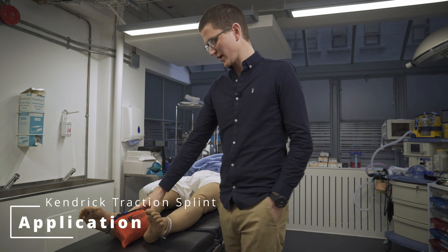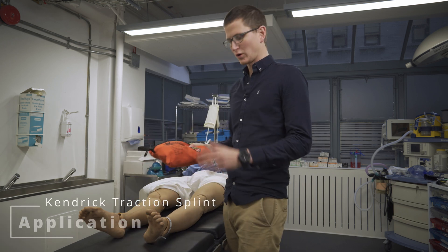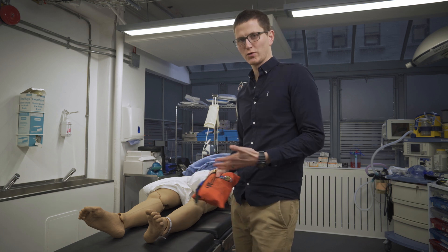Today we're going to be going through the Kendrick Traction Splint. We're going to talk about when to use it, when not to use it, and how to apply it.